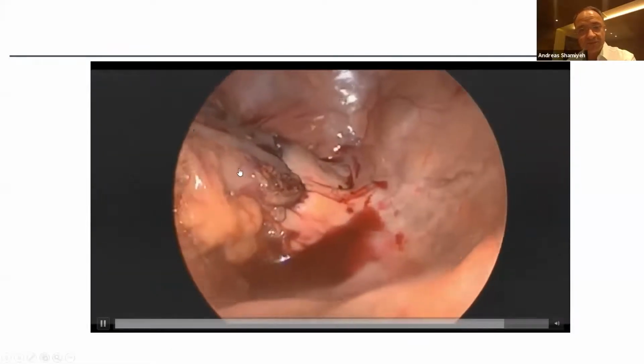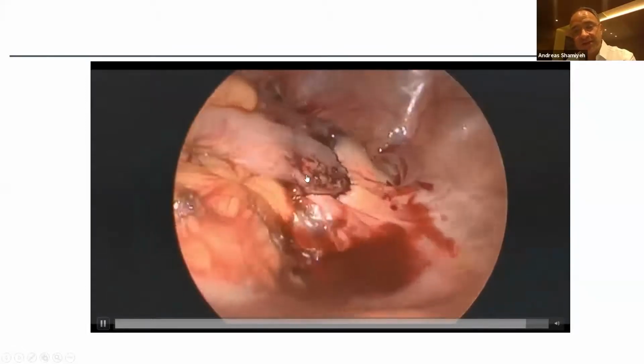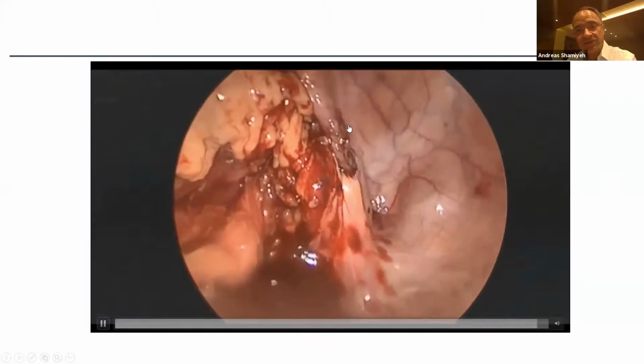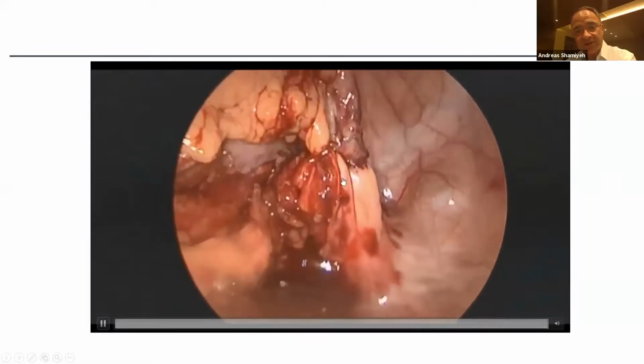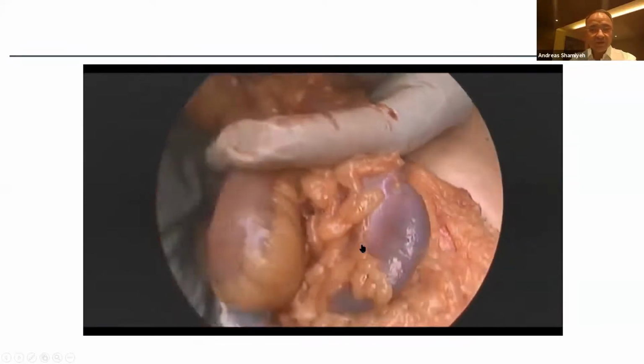And if you check it in just the regular light, you can say now, okay, this looks bad, this is not so good, but it is definitely no good blood supply. Right colon cancer, doing intracorporal, extracorporal anastomosis, that is a case, laparoscopic assisted, doing it extracorporally. And of course, the same style, you have to just wait for half a minute, then the blue color will come. And therefore, it's also important that the meso is not just squeezed to a small incision.